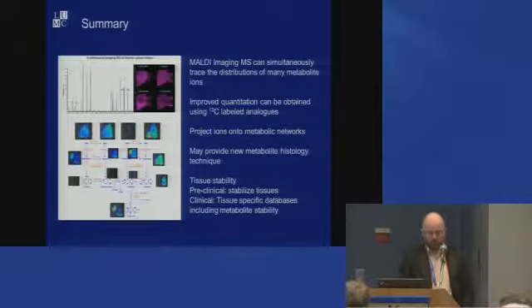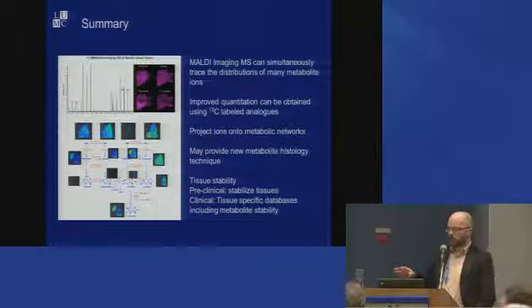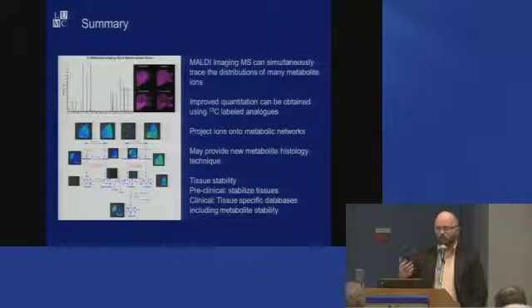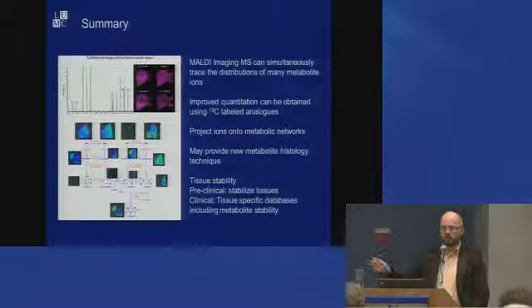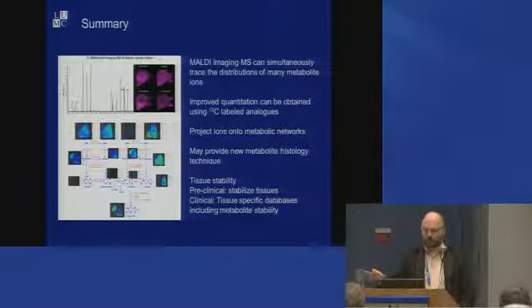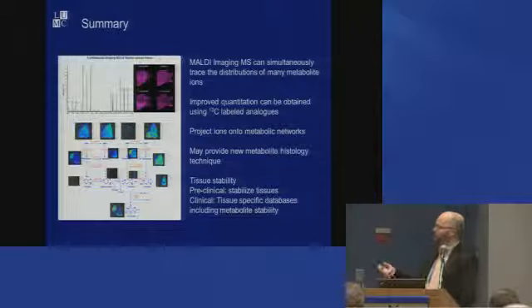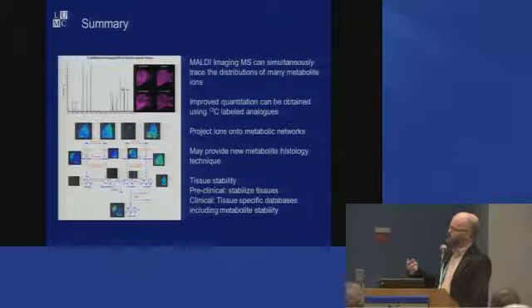So imaging mass spectrometry of metabolites in cancer research is really a very young area. But if you think of clinical assays where you can complement established histopathological methods, it's an area that's basically green fields. I kind of like green fields. It's easier to publish. There are challenges. If you want to know about them, talk to me. I don't think we have the time, thankfully.